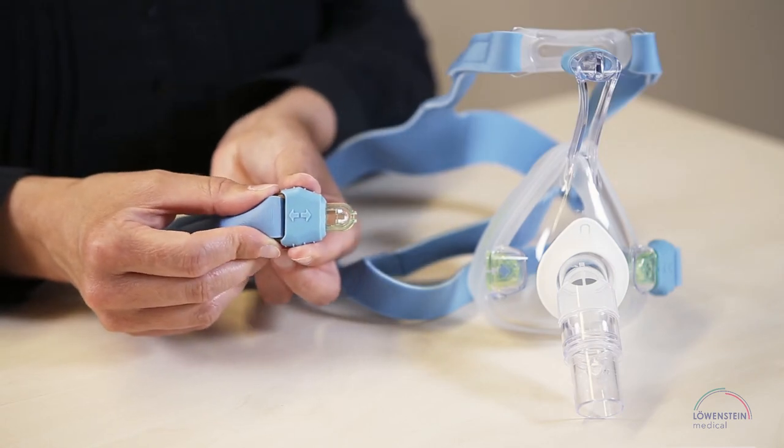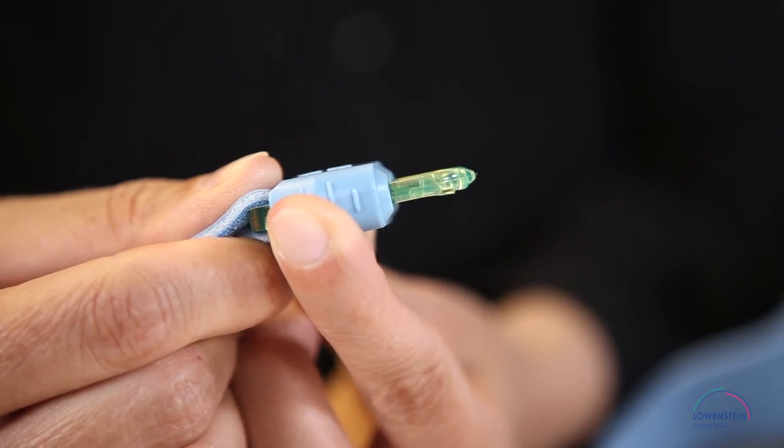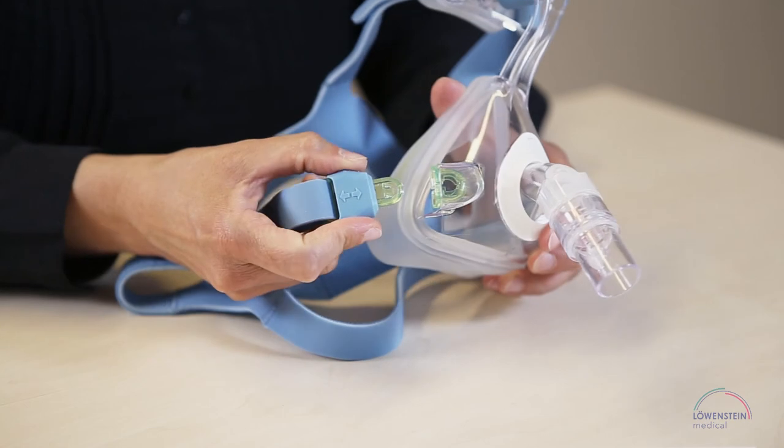The clips for Joyce EZ Next FF differ only in size and color. They function in the same way. When you push the clip's blue operating element backwards, the clip detaches from the mask.